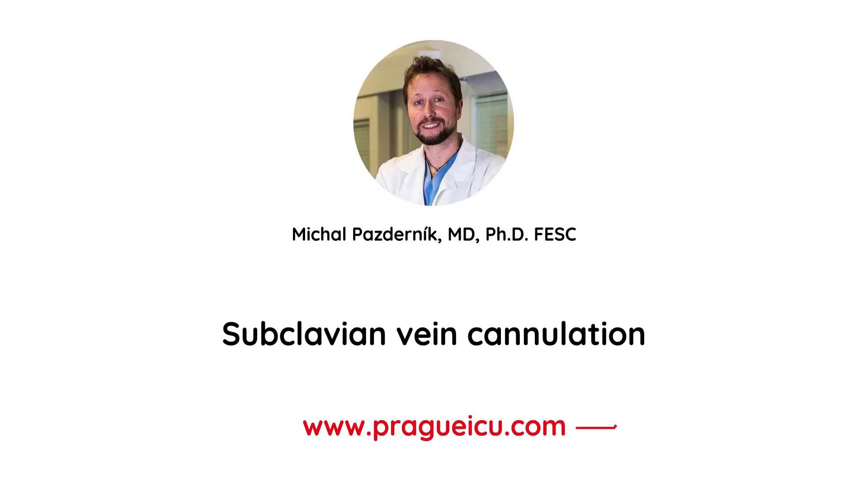Hi guys, I'm Mikhail from Praga ICU and in this video I will demonstrate how to perform subclavian vein cannulation under ultrasound.